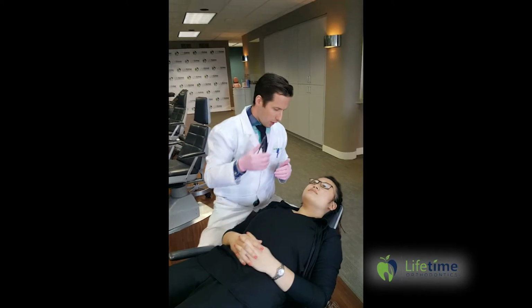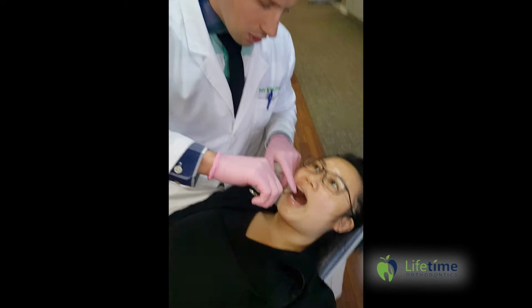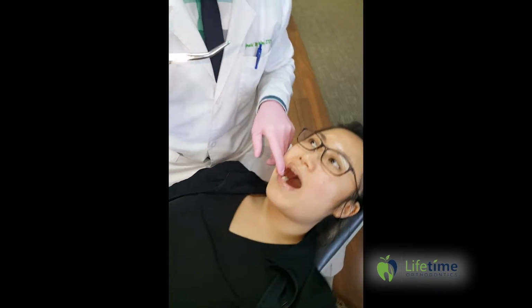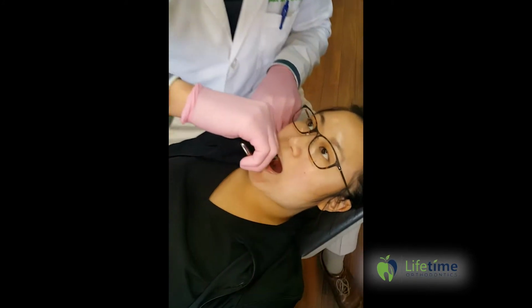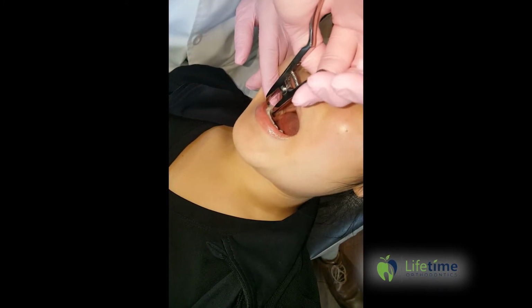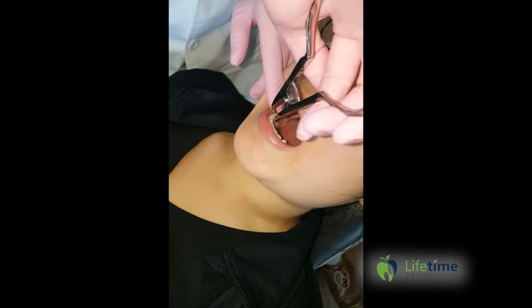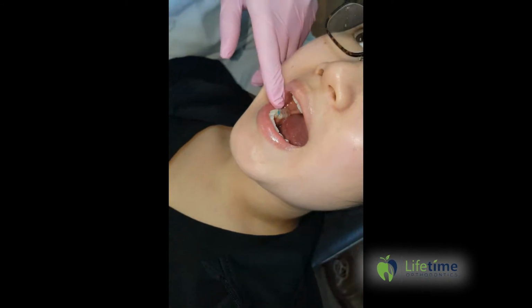But I'm going to show you how to place a separator. So this is how we do it. We use this little separating plier. You of course don't have that, but you can see the concept. What it does is it separates it, makes the elastic thinner, so it allows it to slip in there a lot easier. Okay. Alright, you can see that separator's placed. So that's one way to place it.